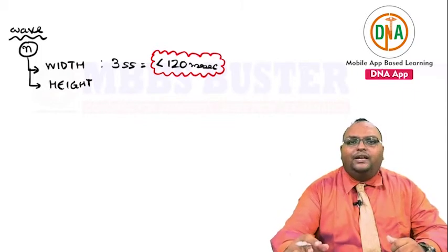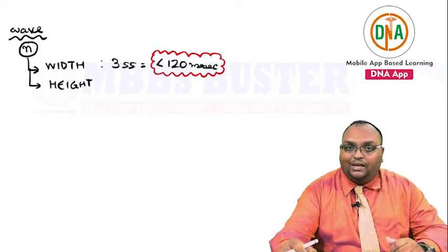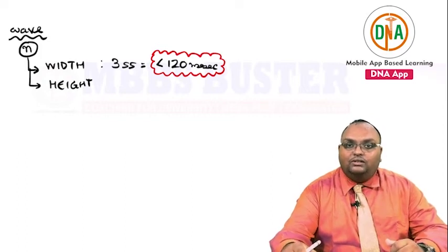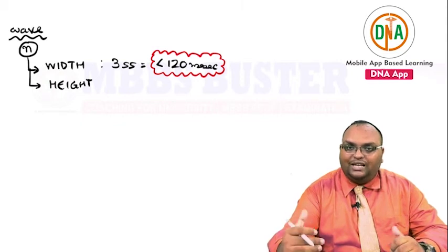The height would depend on whether you're taking the reading in a chest lead or a limb lead. I told you as a rule, usually the cutoffs for waves are higher in the chest leads, because the heart is closer to the precordium than the limbs.